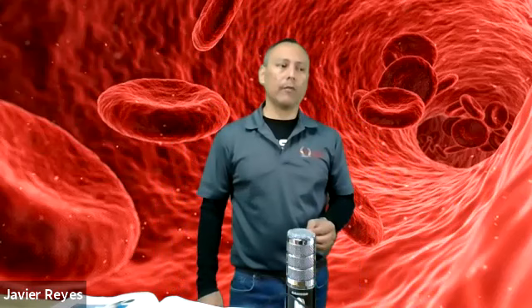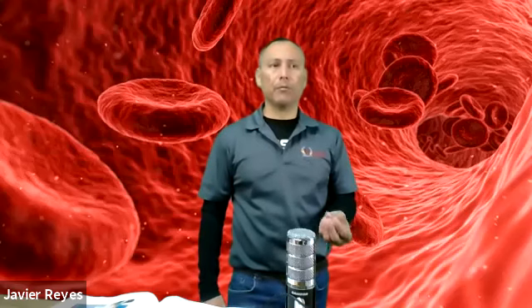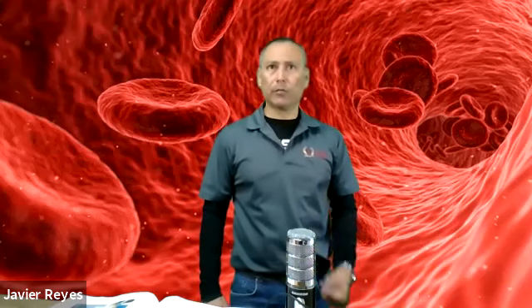Potassium levels, the order of draw. We said earlier we have a slight change in the order of draw for capillary punctures. The abbreviation that I use to remember this is BEOS. B is for blood gases. Blood gases are always collected first when you're doing a capillary puncture, followed by your EDTA specimens, which can be various. You have other additives after that. And then lastly, your serum specimens. Remember, the serum are the ones that clot. So you have blood gases, EDTA, other additives such as your heparins, and lastly, your serum specimens, which are the ones that coagulate.